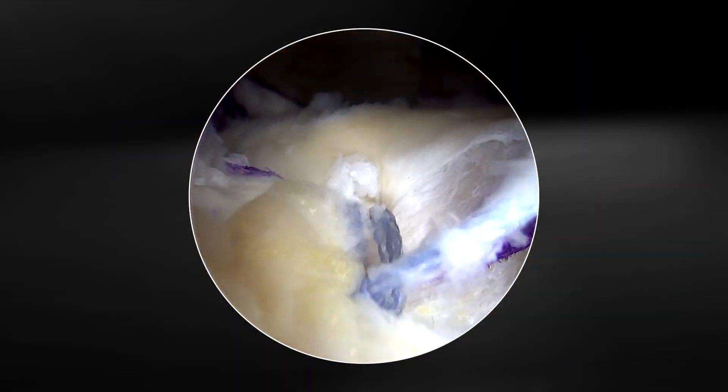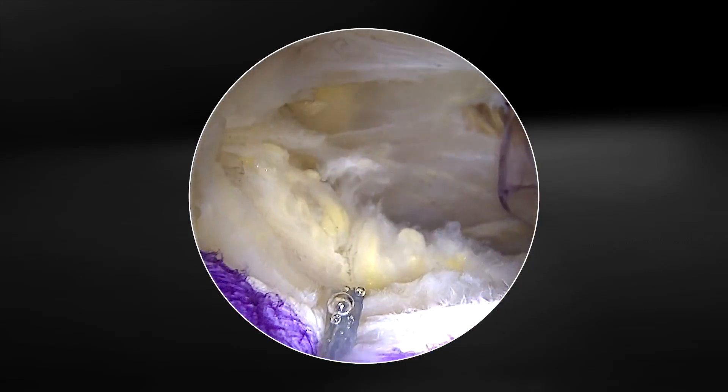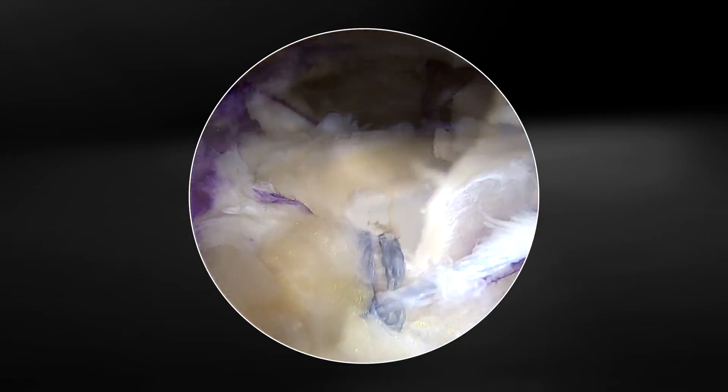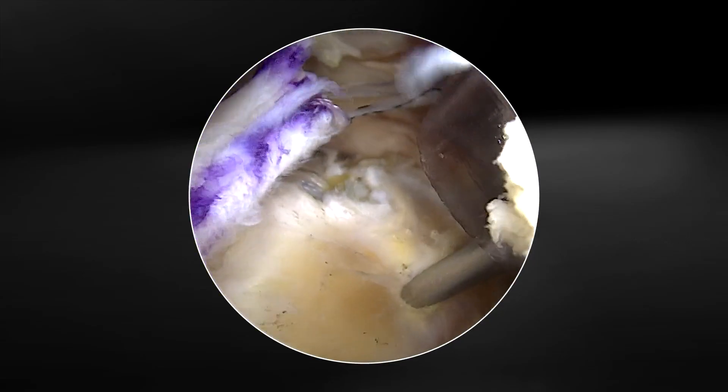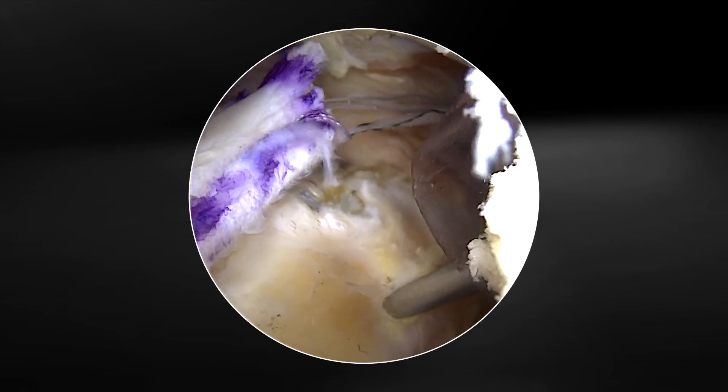Now I've got a fourth stitch — one on the outside corner, our third stitch symmetrically on the anterolateral aspect. For the lateral row we want to be just slightly distal and lateral to where the patch will naturally step down.